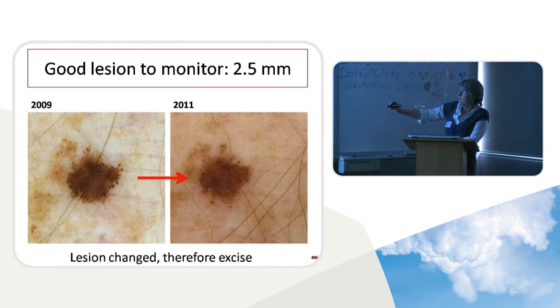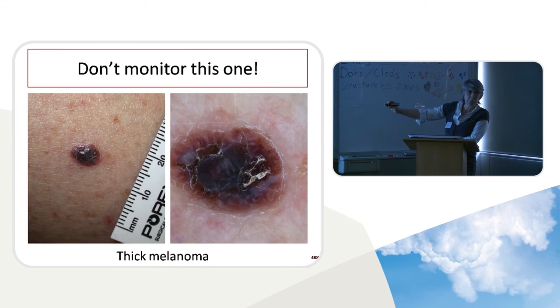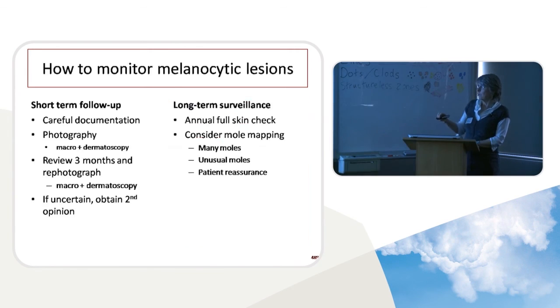This one is a nodule. It's a bump. It's quite small, only 4 or 5 millimetres. You get out your dermatoscope. It's got the white lines on polarised dermoscopy. It's irregular in colour and structure. That's a melanoma. It's a thick one.